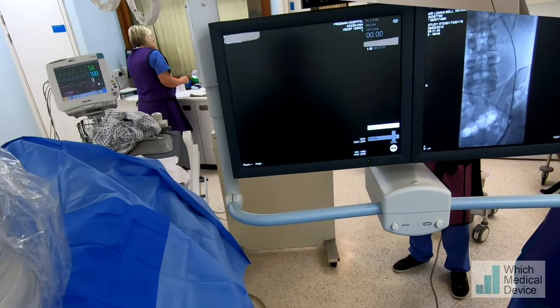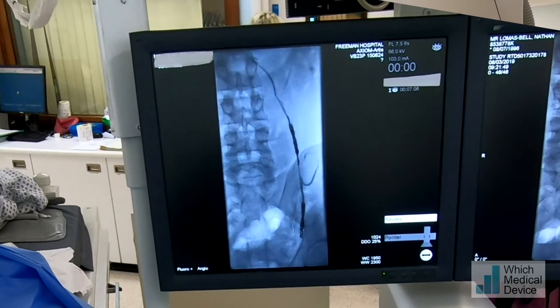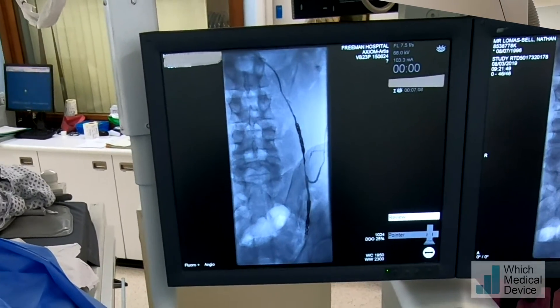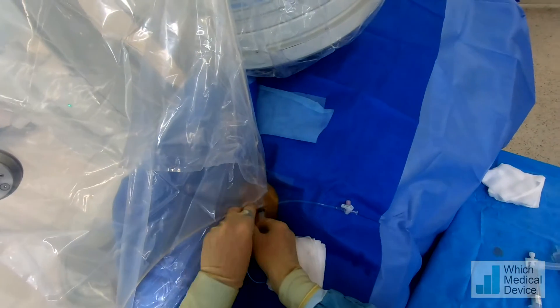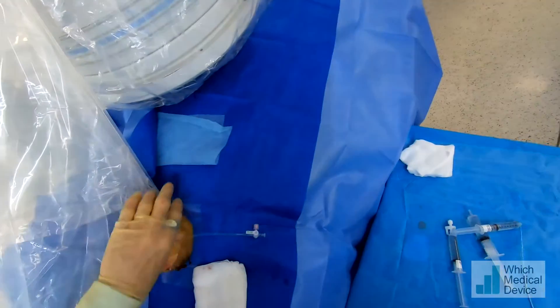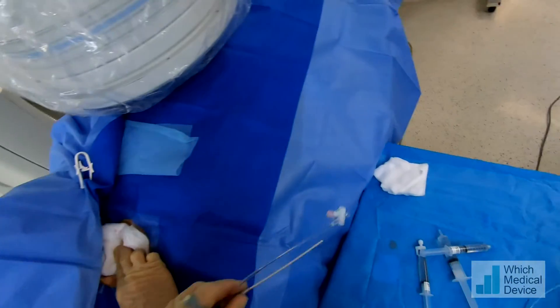We're just going to check now with a bit of contrast, going back up the gonadal vein right to its origin. And you can see we've completely occluded that vein now, so we should get a good result. We're just going to take this catheter out, take the sheath out, and that's finished. Thank you.